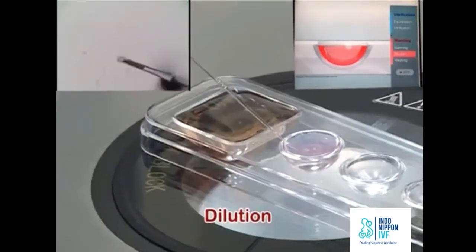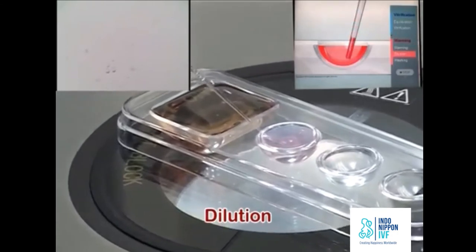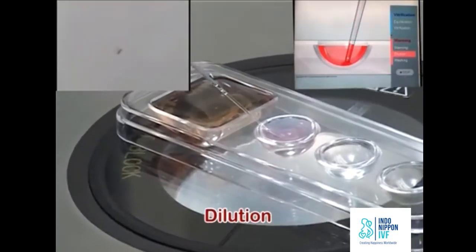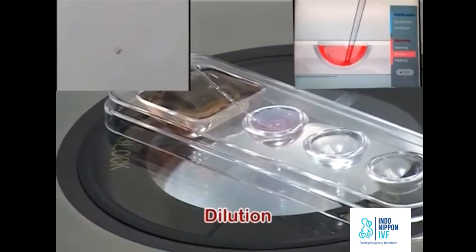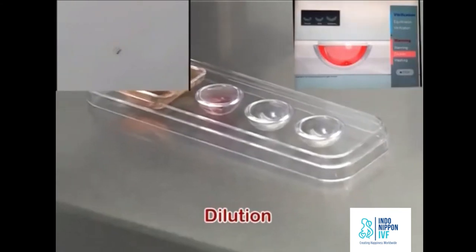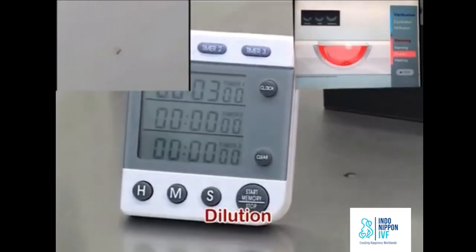Transfer TS to the bottom center of DS and gently put the oocyte at the bottom of TS layer in DS well. This is for the most gradual displacement from TS to DS. Wait for 3 minutes.